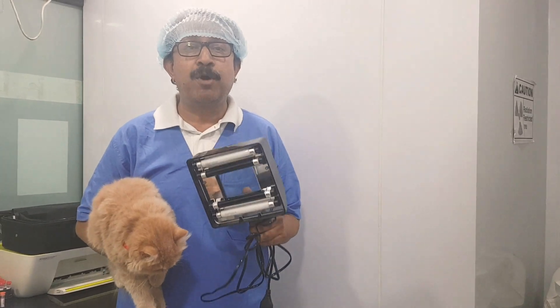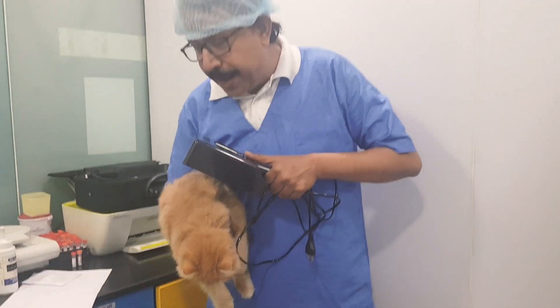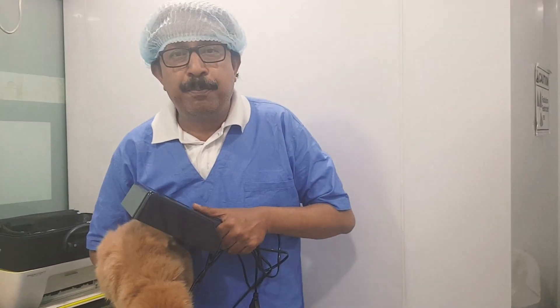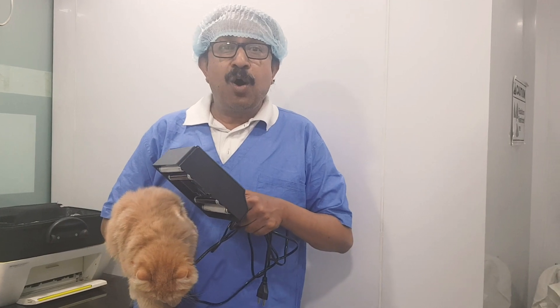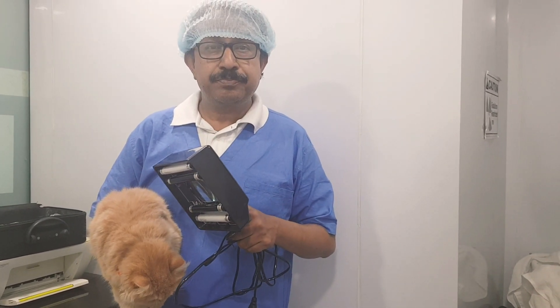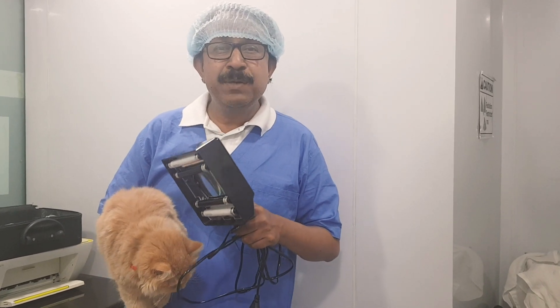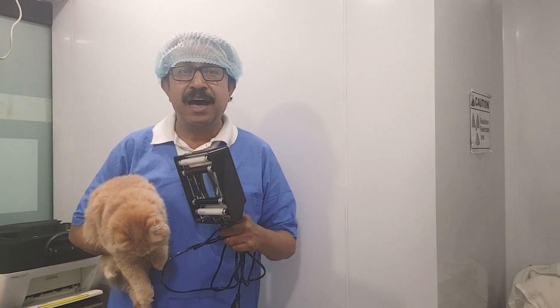The Woods lamp must be turned on for at least five minutes prior to its use — this is very important. Simply plugging it on and immediately using it on the animal is not proper. You must warm it up for at least five minutes before use.